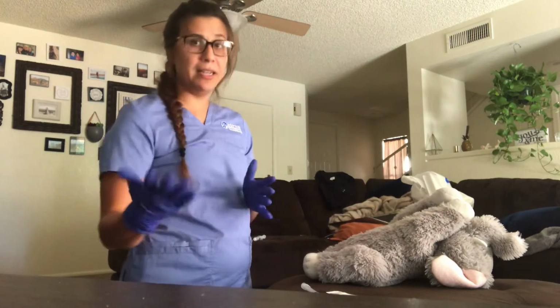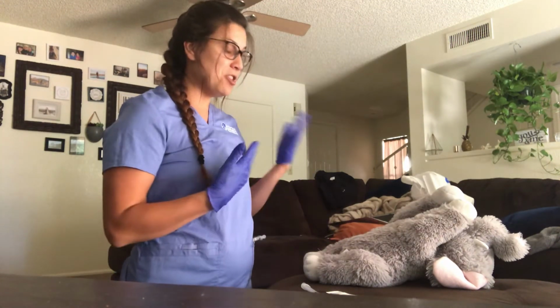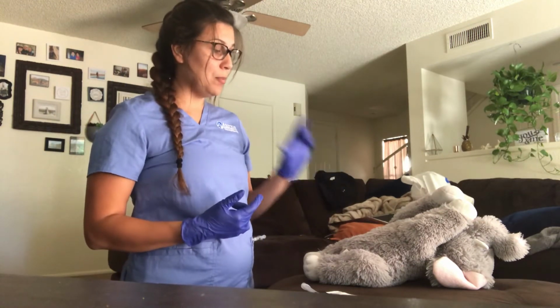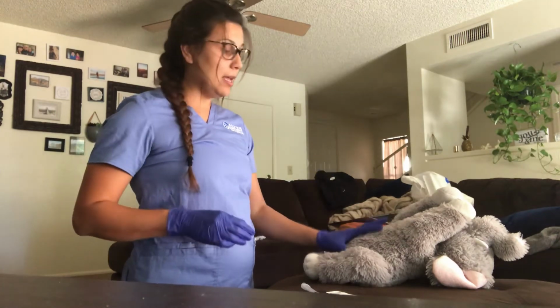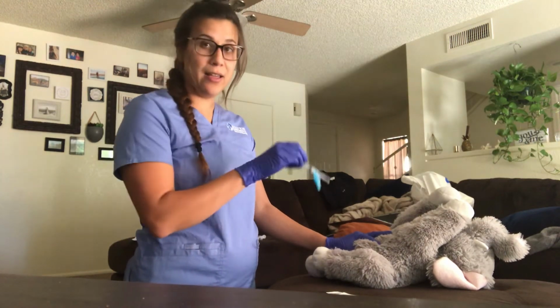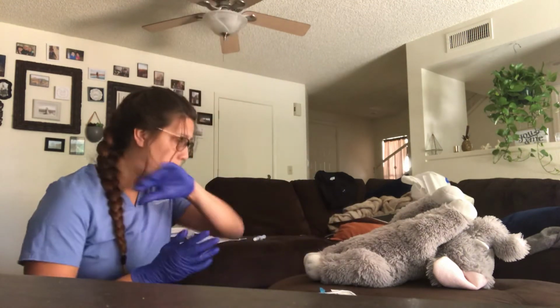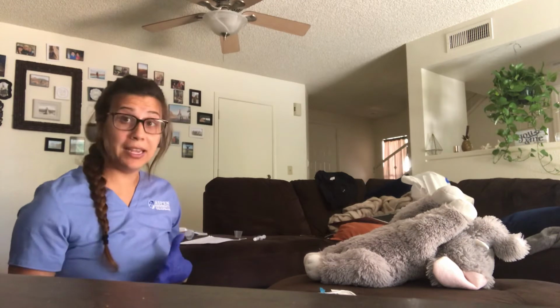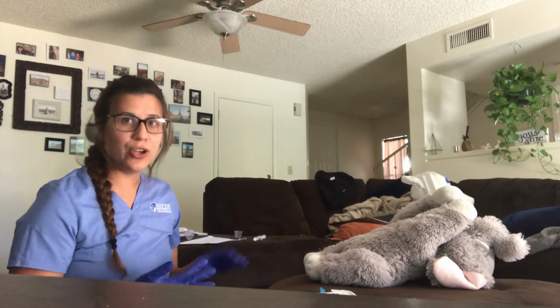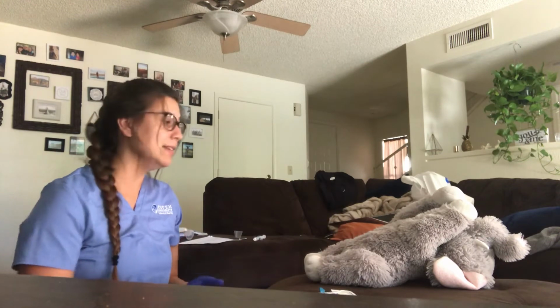So we're going to do abdomen just because it's a little easier with my patient. You also need to choose a needle. In order to do that, you need to make a fold of the patient's belly. You just pinch, and then you want to make sure that you choose a needle that's at least half of that size. So you choose your needle, and then you want to palpate the area. You're checking to make sure that the area isn't tender and there are no hard masses, so you're just lightly palpating. If there is tenderness or hard masses, choose another site.